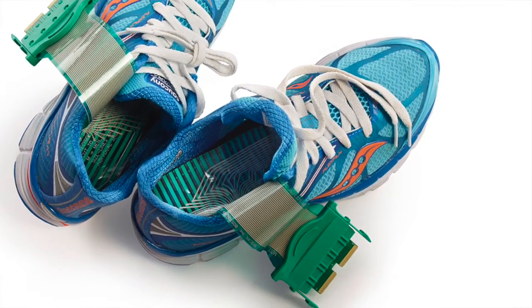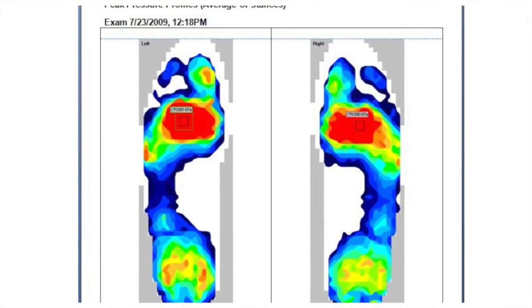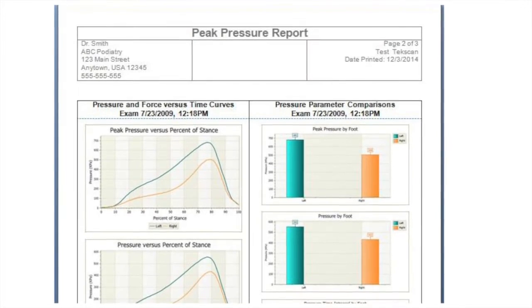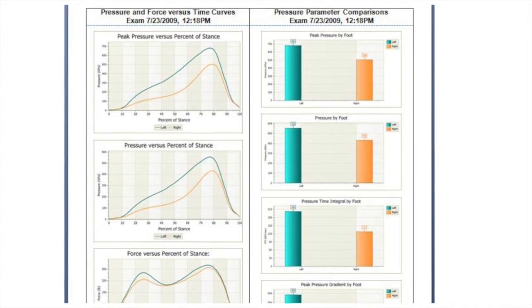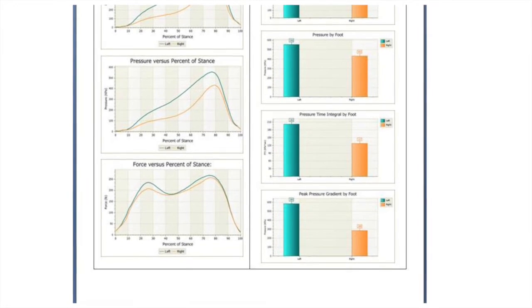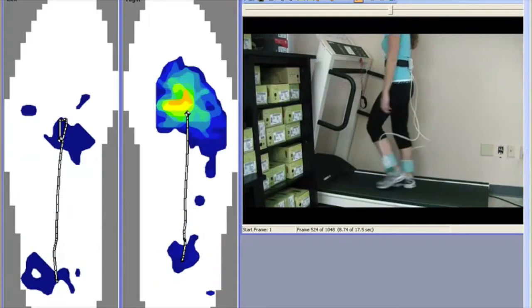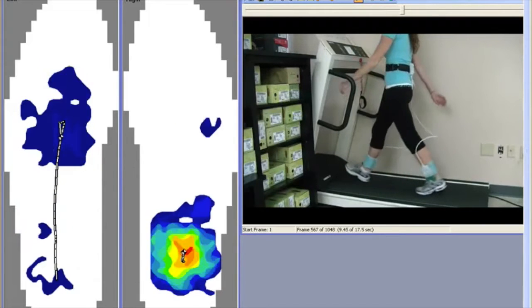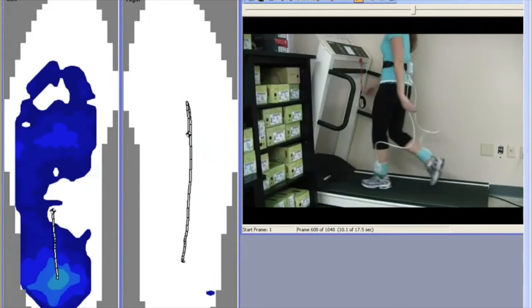First, you can screen your client's plantar pressure distribution and evaluate areas of relatively high and low pressure, or do something more sophisticated like analyze center of pressure. These pressure variables have a good evidence base across multiple populations, including those with high-risk feet and those with musculoskeletal injuries. I think the best part is the application of the insoles to the prescription of foot orthoses, because it's the ability to systematically design, evaluate, and modify your client's foot orthoses, which make this a really useful application.